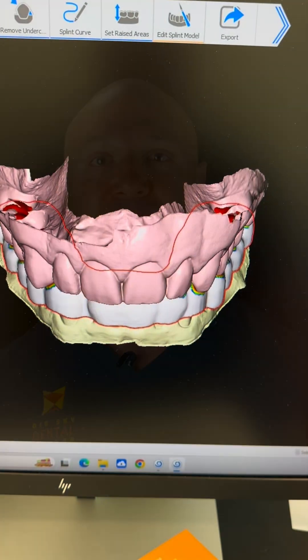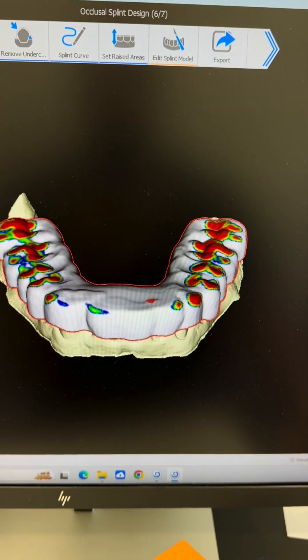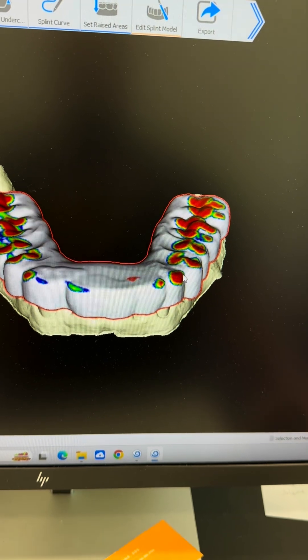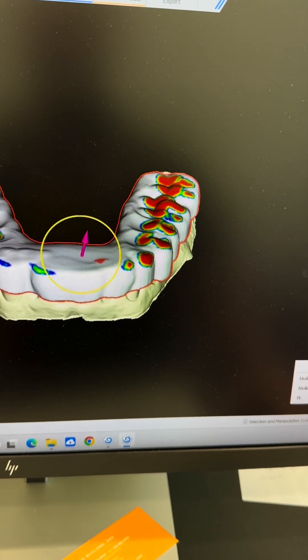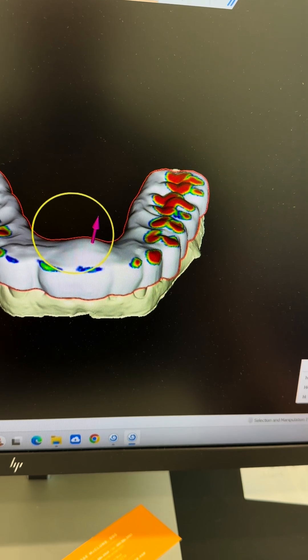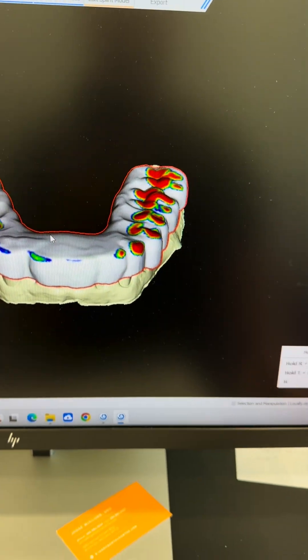So I'll show you the device now. All right, so we're over here. This is where we would make devices to be printed. You can see right now we're in the process of making a TMJ appliance to help with someone's jaw pain. We move this around and kind of design and customize it however we want.